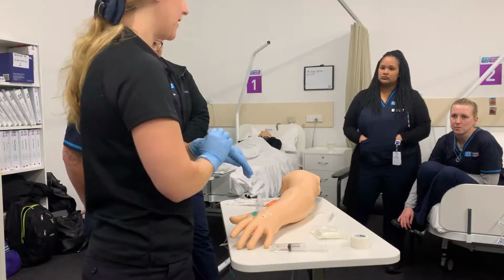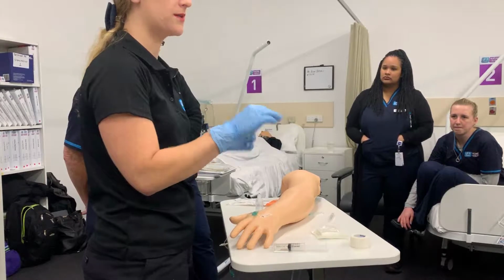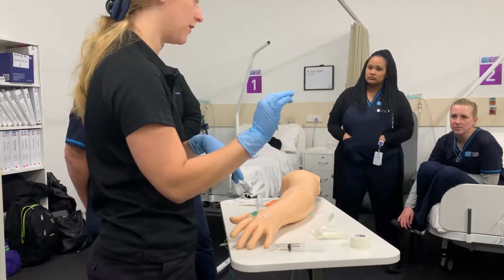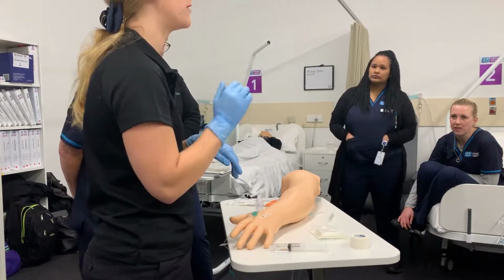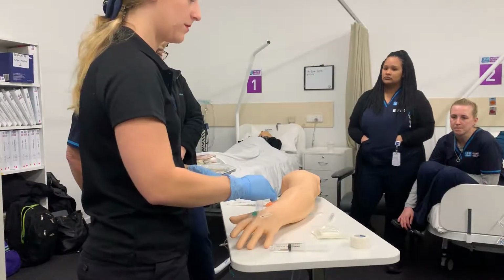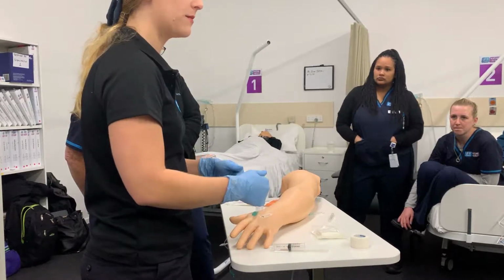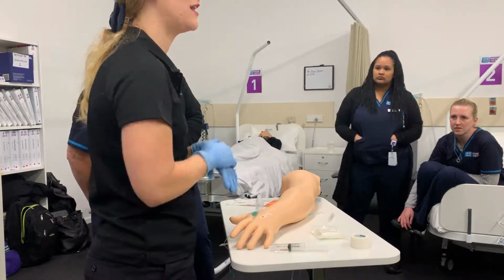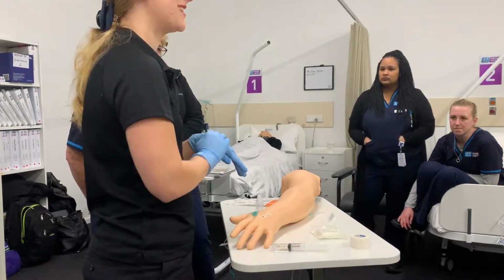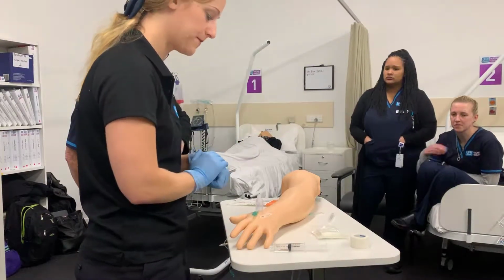Because it's in a vein, there will be lots of blood if you're not ready. Now, arteries spurt, veins run like a faucet. So you should not see any spurting of blood, but enough blood could come out that it could scare the patient. The tape might be a little bit painful when it comes off, but actually removing the cannula, the patient should have no pain whatsoever. And if they do bleed, they don't have any pain when they're bleeding. You just have to apply pressure, okay?